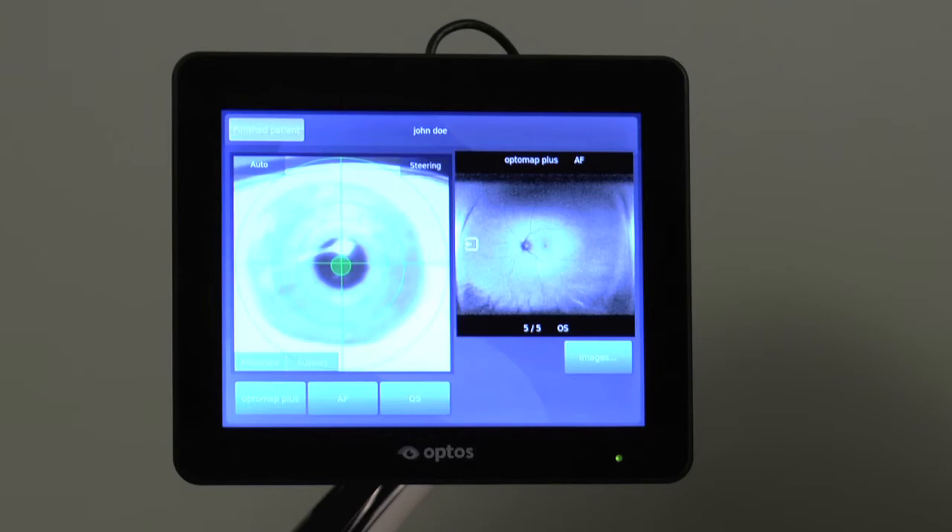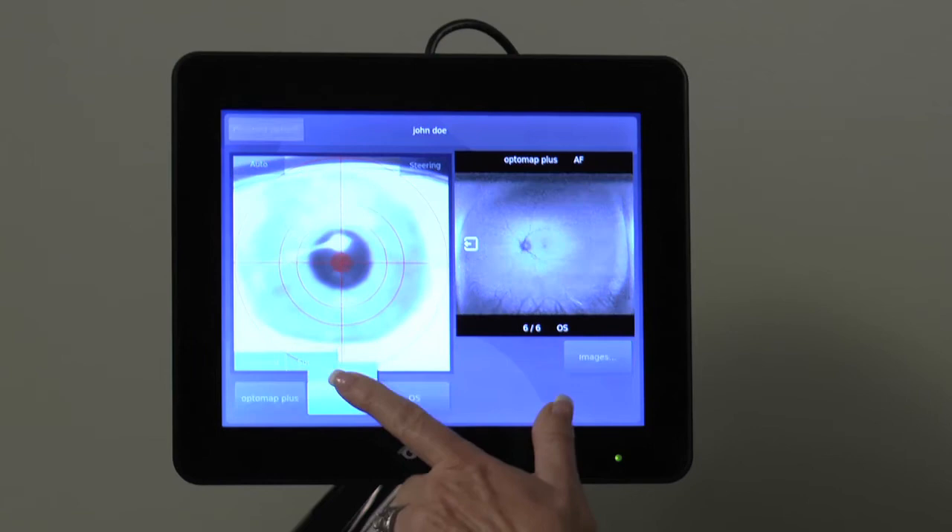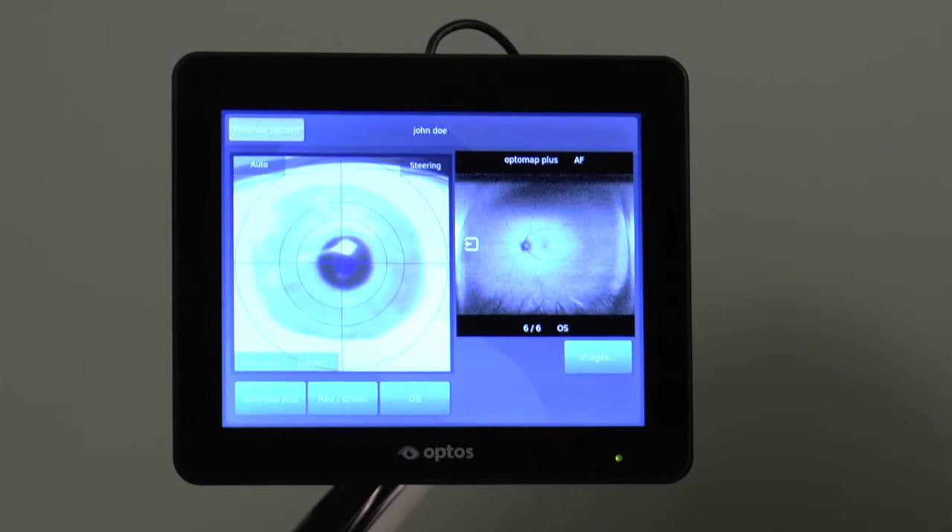Now switch back to red-green and remind the patient they are free to blink between images, but they should open both eyes as wide as possible and not move or blink when told just before capture.